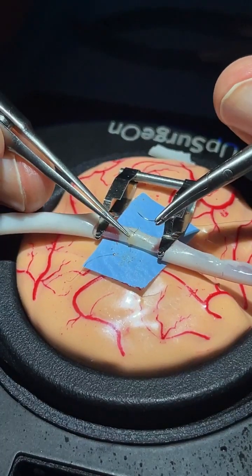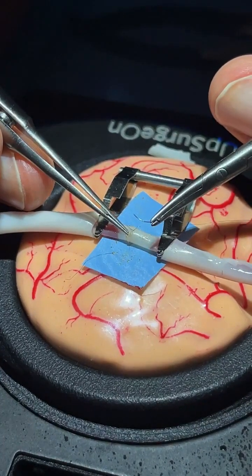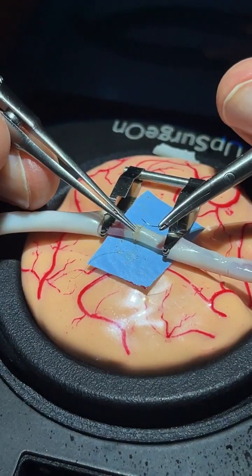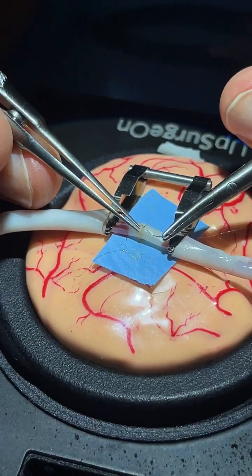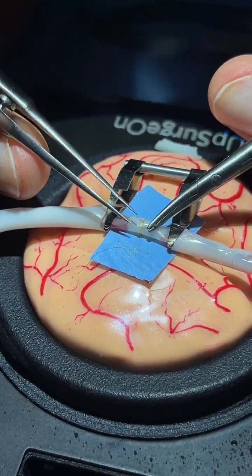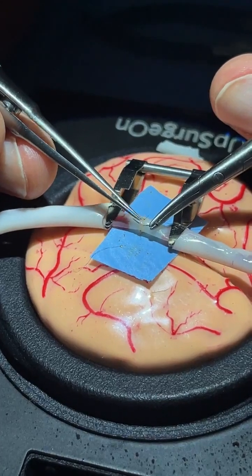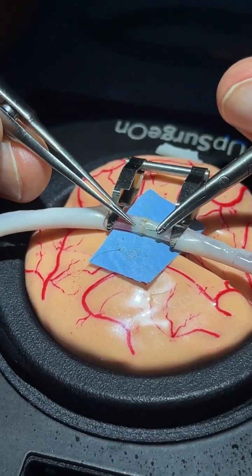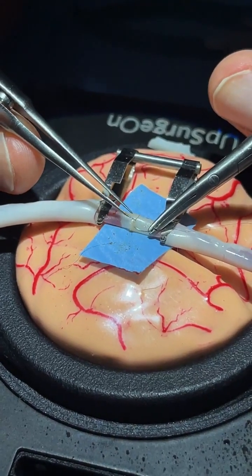When putting the stitch on the next side, you have to enter with the forceps into the lumen, open the forceps, and pass with the needle. This is to avoid pinching the intima of the vessels, and to avoid creating damage on the intima that could lead to thrombosis.